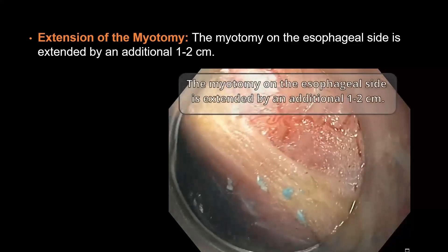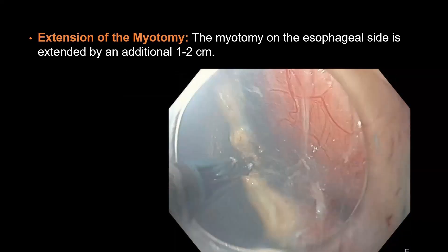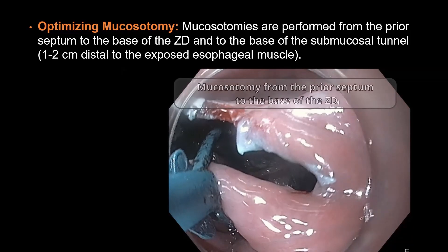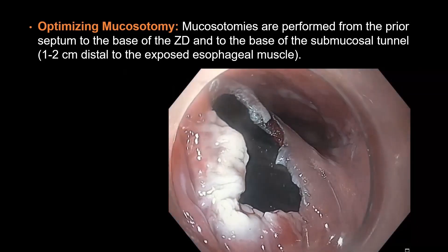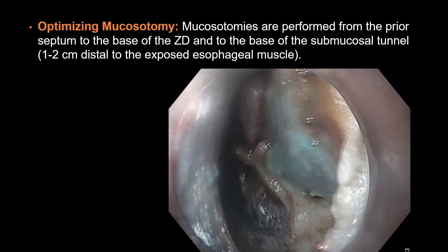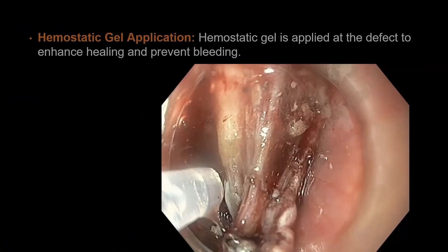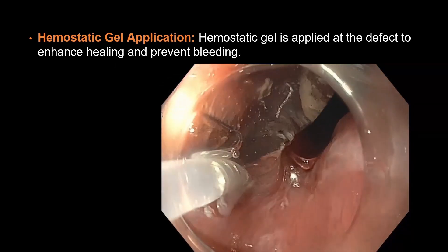Extension of the myotomy: the myotomy on the esophageal side is extended by an additional 1–2 cm, aiming to prevent recurrence. Optimizing mucosotomy: the mucosotomies extend from the prior septum down to the base of the Zenker's diverticulum, and from the prior septum to the base of the submucosal tunnel, approximately 1–2 cm distal to the exposed esophageal muscle, aiming to remove any residual mucosal flaps. Hemostatic gel is applied at the defect site to expedite healing and prevent bleeding.